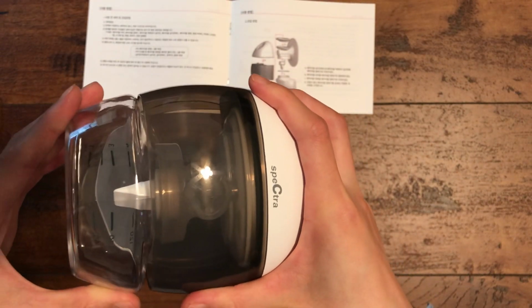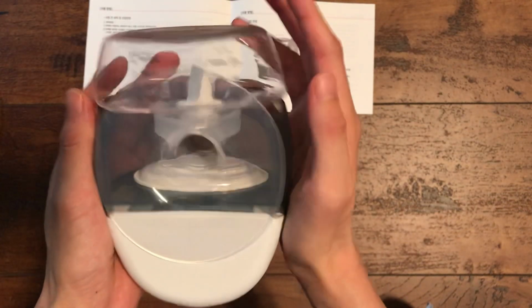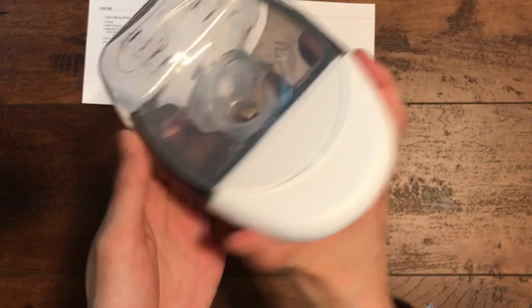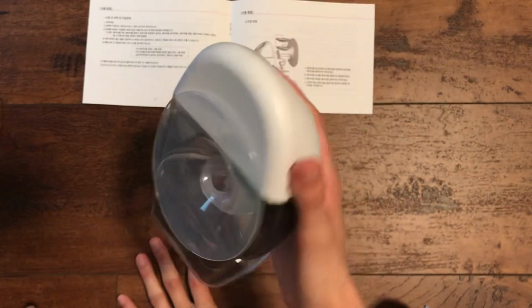So you push it in, and then when you think that you're done pushing, I would turn it around and push it one more time. I push it in until I feel it's secure. And then you can test it by trying to pull it out, and then it's in. So that's how you assemble the unit.